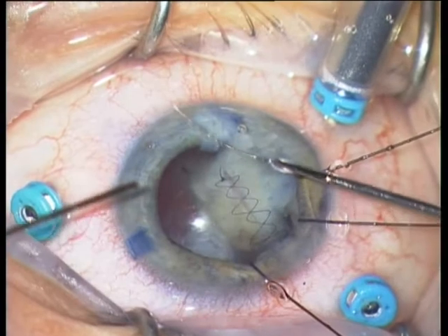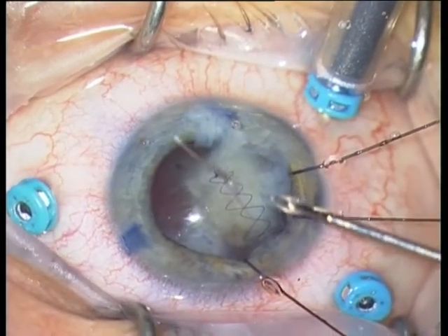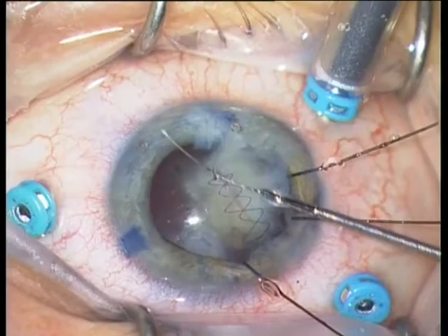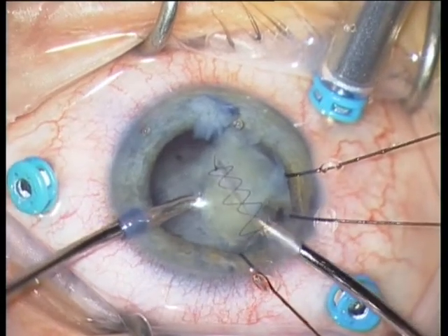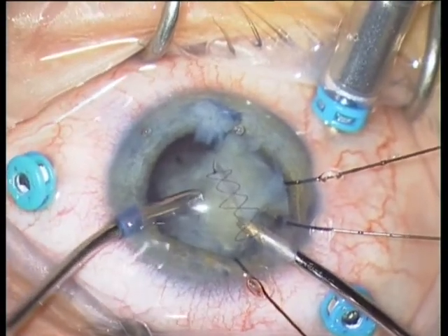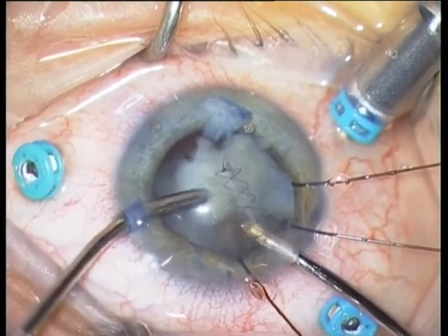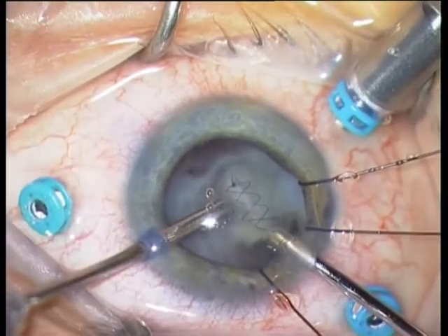You can see it is an eyelash. We can be lucky that we injected antibiotics because this eyelash was surely not sterile. We continue with irrigation and aspiration.